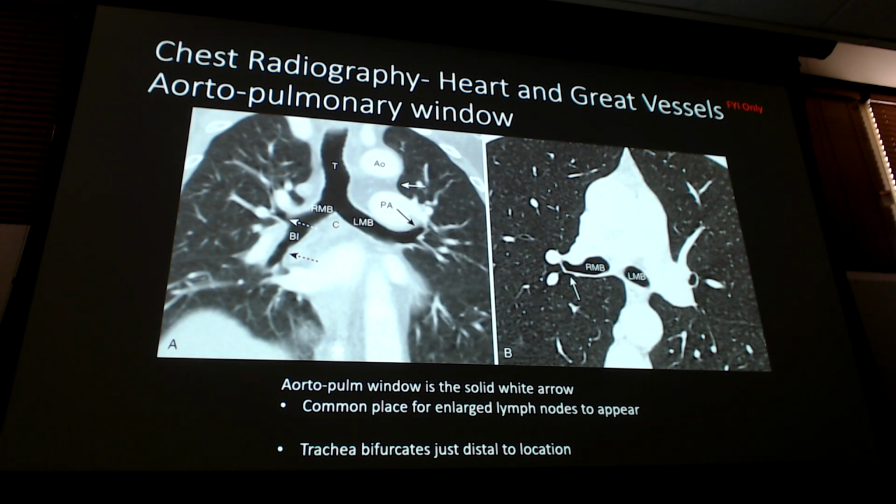I'm not going to make you pull lymph nodes out on CT or X-ray. I'm not. There's no benefit for you guys learning how to do that. But sometimes you will see those lymph nodes in there. Inflamed, angry, but FYI, upper right hand corner. It's small, but it's there.